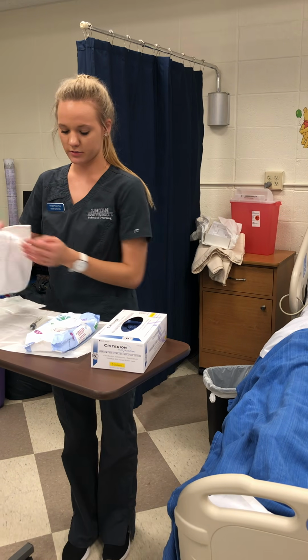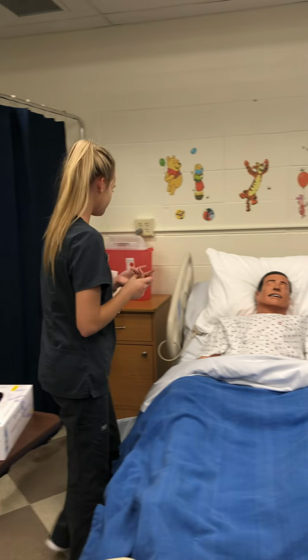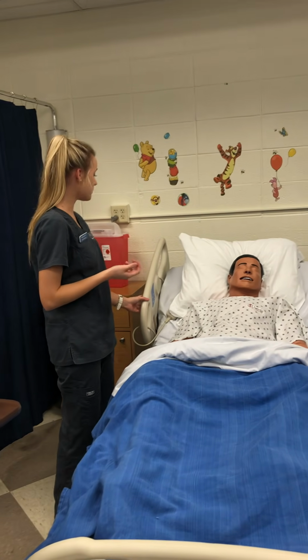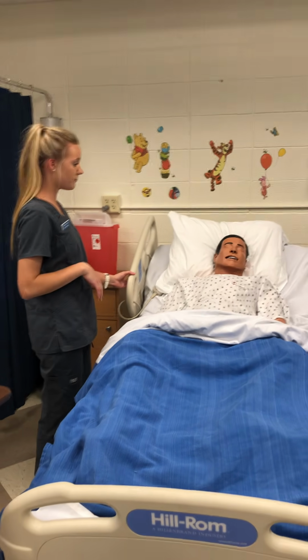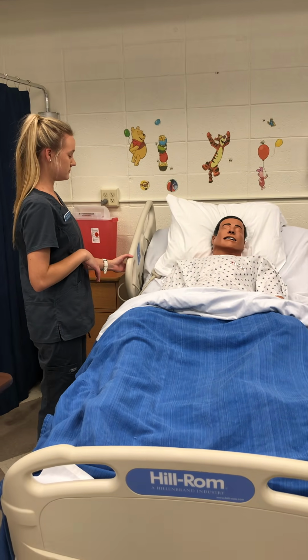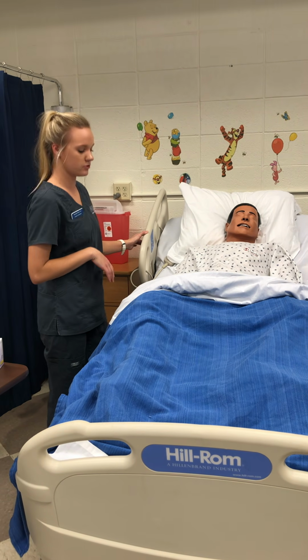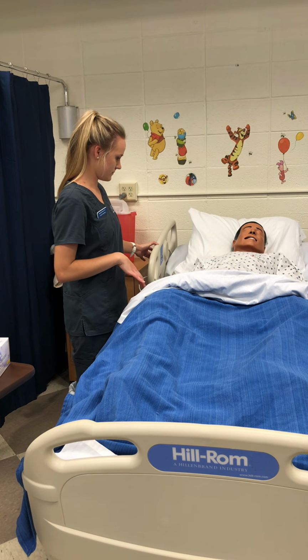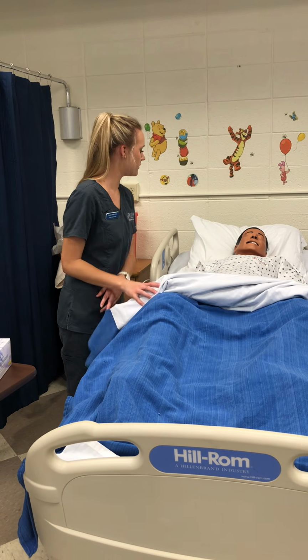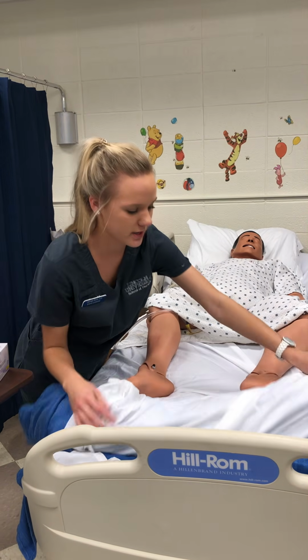So now it's a few days later. My doctor has an order to remove the catheter, so I'd come in and let Mr. Jones know, Mr. Jones, the doctor's ordered for us to remove your catheter, and tell him why. I'm gonna raise him back up. Lay him back down in the supine position. Mr. Jones, are you doing okay? Good. Mr. Jones, I'm gonna expose you now, okay?